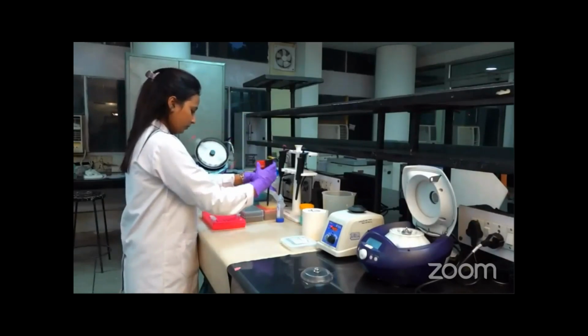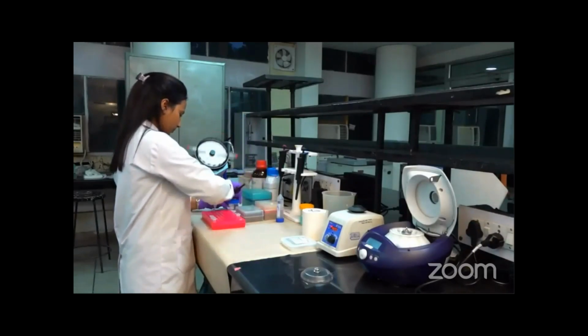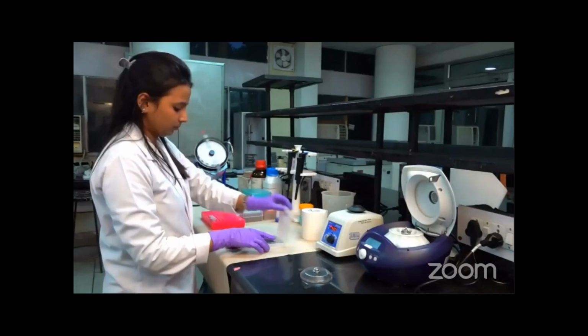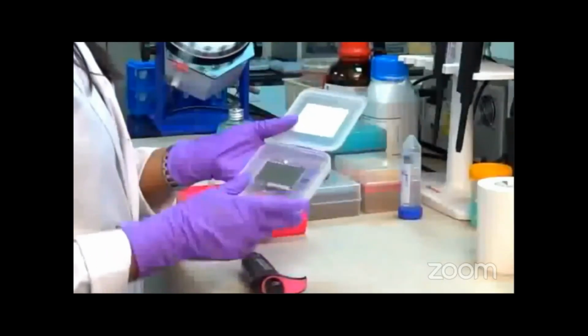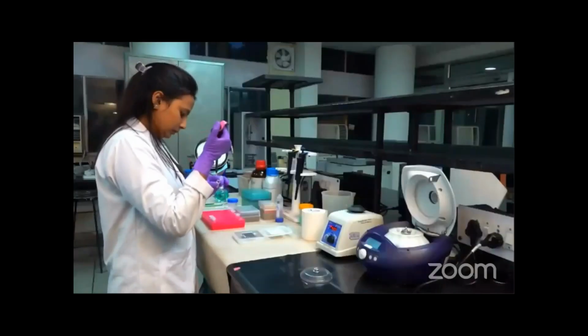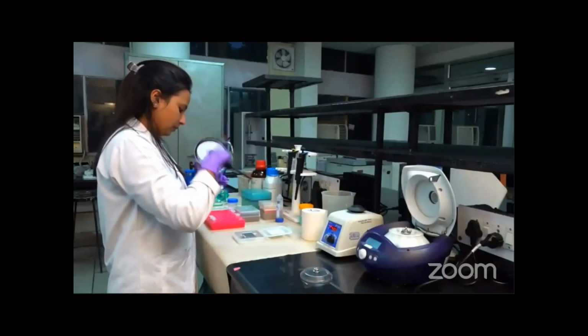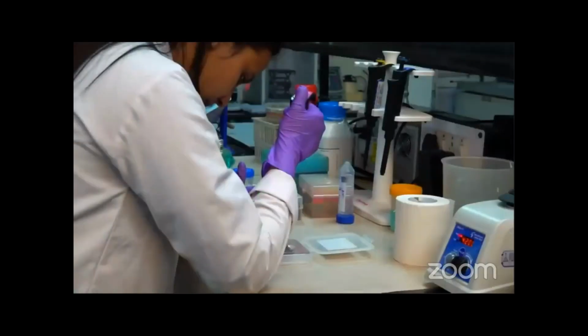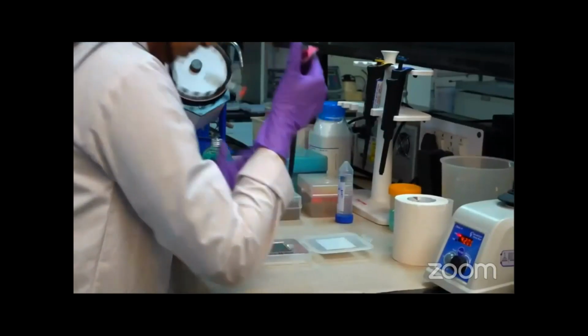After washing twice, the pellet obtained by centrifugation has to be resuspended in 100 microliter of double distilled water and mixed properly. The MALDI plate can be of two types, either a reusable steel plate as we are using here, or a disposable plastic plate. We add 1 microliter of the yeast suspension to the MALDI plate.